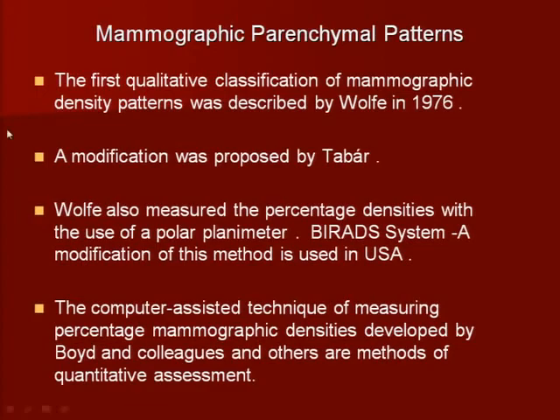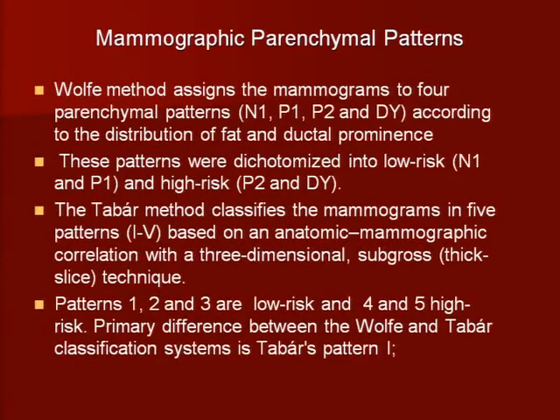This first qualitative classification was actually described by Wolfe in 1976. Then Tabar modified it a bit later. For the BI-RADS system also, they did a modification of the Wolfe. And using the computer-assisted technique, from qualitative classifications, they've gone to quantitative assessment. Boyd and his colleagues have done that. So you have a variety of classifications for mammographic parenchymal pattern.